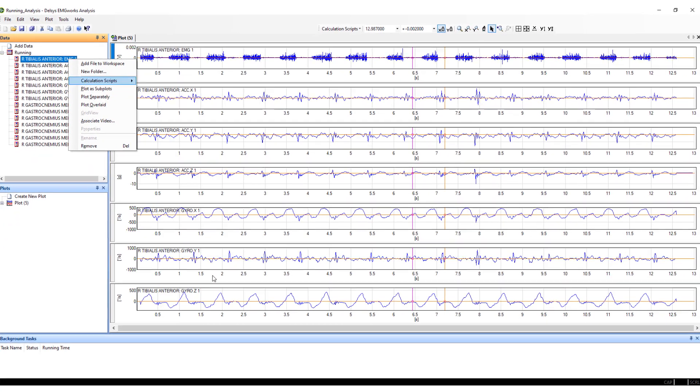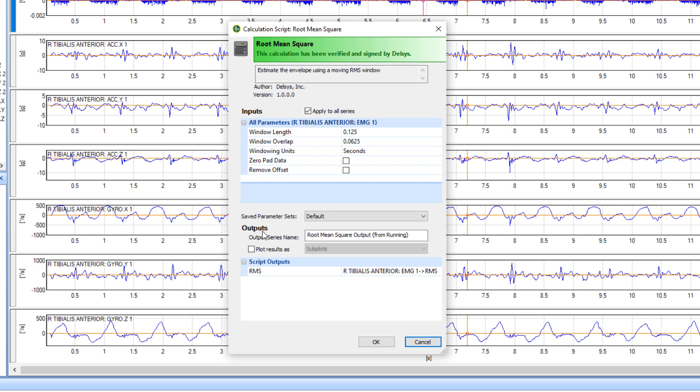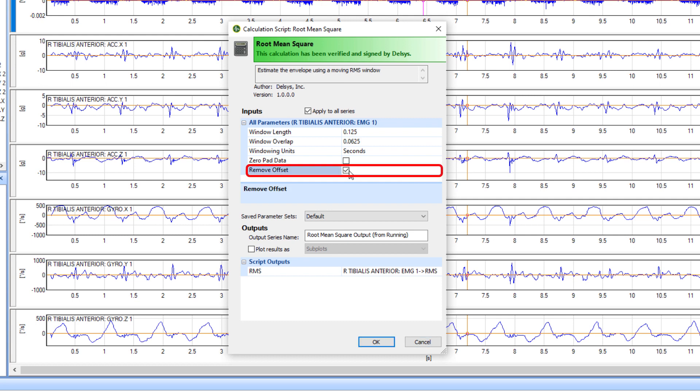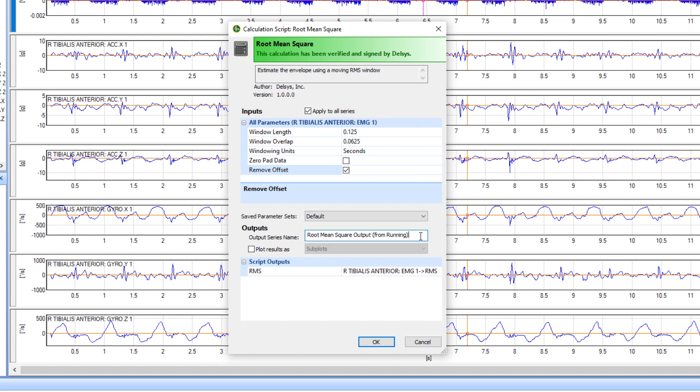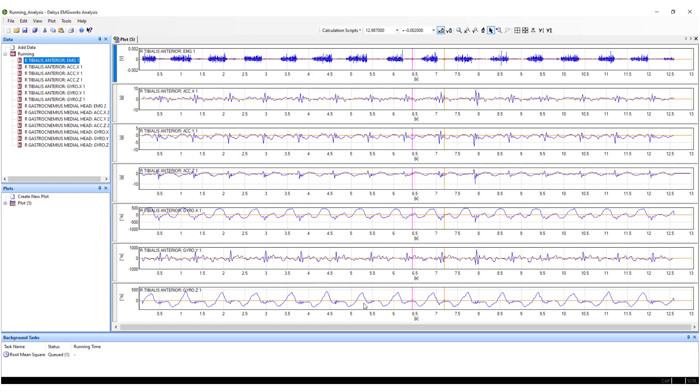A parameter window will appear detailing the window length and window overlap, both of which can be changed by the user. The baseline offset can be removed by checking the Remove Offset box. The file name and channel name can be changed in this window. Select OK and the calculation script will run in the background, appearing in the data window when finished.